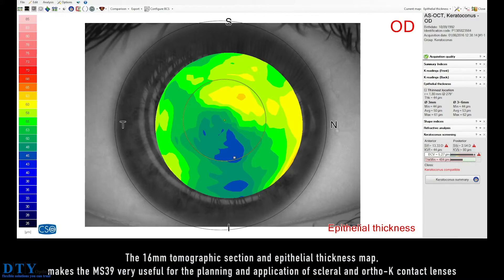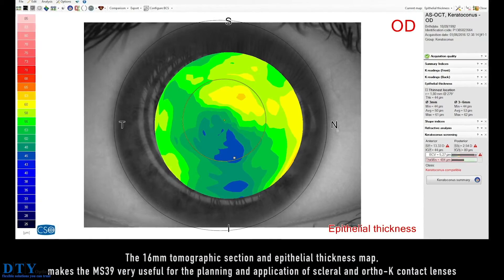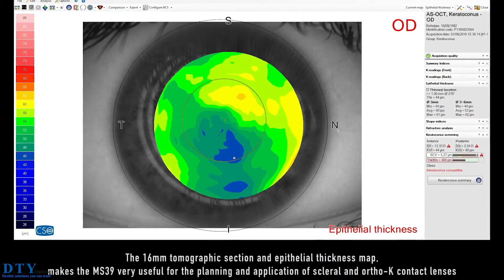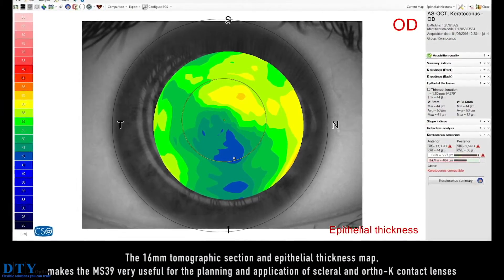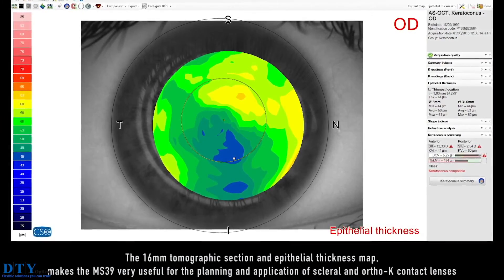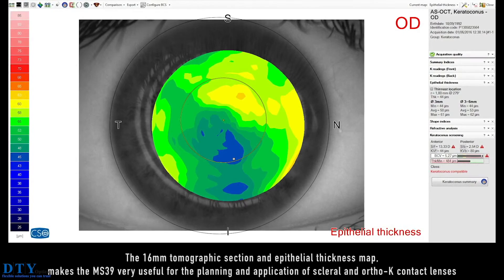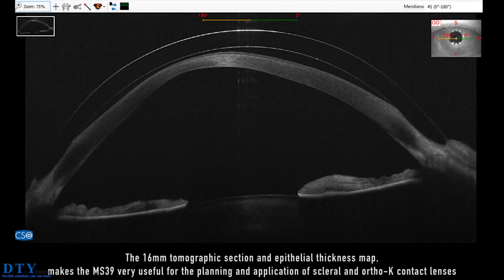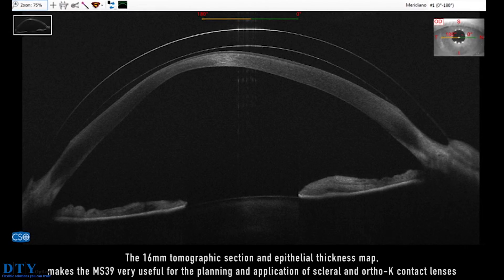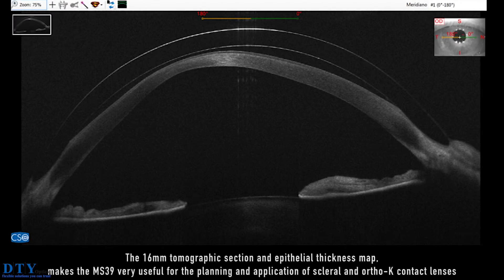The 16 mm tomographic section and epithelial thickness map makes the MS-39 very useful for the planning and application of scleral and ortho-K contact lenses.